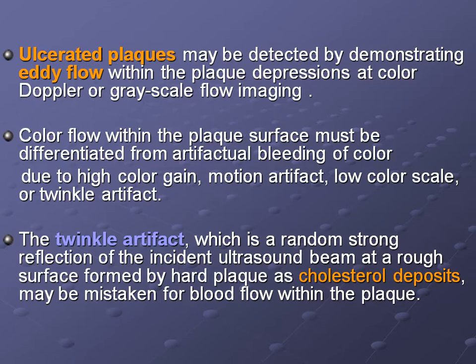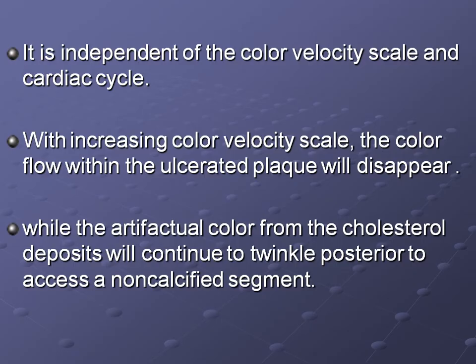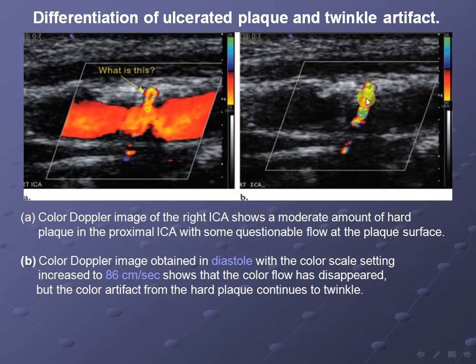When you make an ultrasound for the gallbladder and you see cholesterol stones, you see there's an echogenic line behind the stone, okay? The same thing happens in the arteries. If there's a cholesterol deposition, okay, then you might see this bright color behind the cholesterol deposit, posterior to it. When you put color Doppler, there will be an artifact behind the cholesterol deposit, okay? Like, you can see this one here. Just a line of color, nothing to explain it. Okay, this is called twinkle artifact.